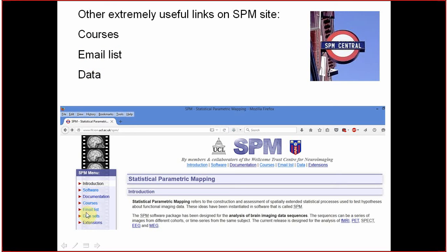Courses, mail list, datasets. If you want to be able to understand well how the neuroimaging analysis is performed in SPM, how to use it, and how to improve your qualification as a neuroimager, you should definitely see the courses.